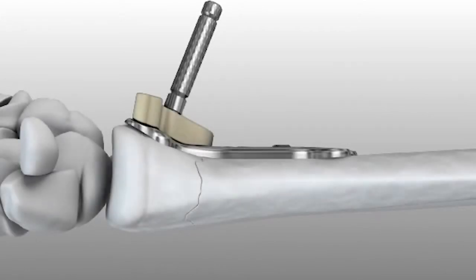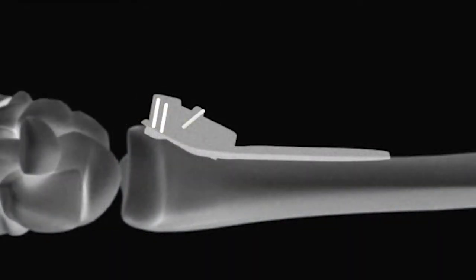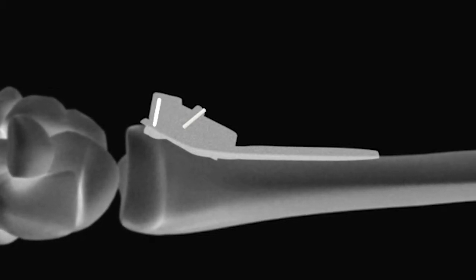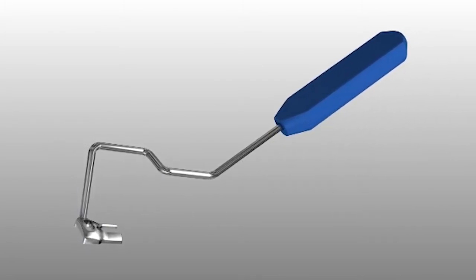To verify plate placement from a lateral view, line up the 2 parallel radiopaque posts. A single plane is created by the goal posts beneath the subchondral bone, showing trajectory of the distal screw row. If the posts do not target into the joint, then the distal screw row will not either. This can be achieved by lifting the hand in neutral rotation so that the forearm is 20 degrees to the OR table. A plate positioning handle is also available in the AccuLock-2 system.